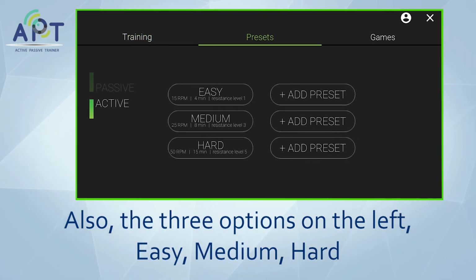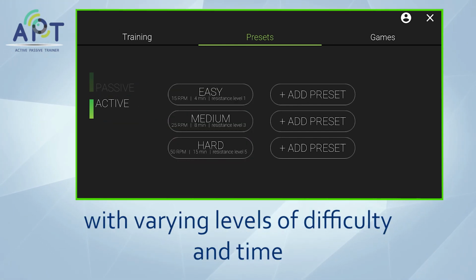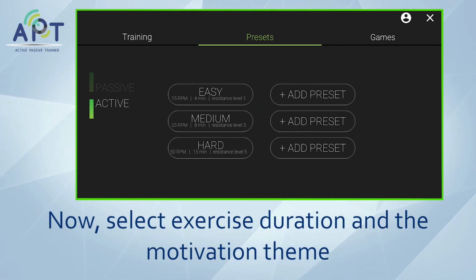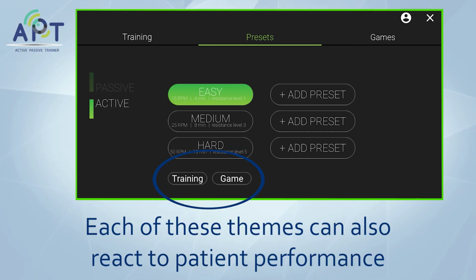Also, the three options on the left, Easy, Medium, and Hard, are preset programs that we developed for you with varying levels of difficulty and time. The right side includes an option of adding a preset program developed by the caregiver. Now, select exercise duration and the motivation theme, gaming, trip, or against the clock. Each of these themes can also react to patient performance.